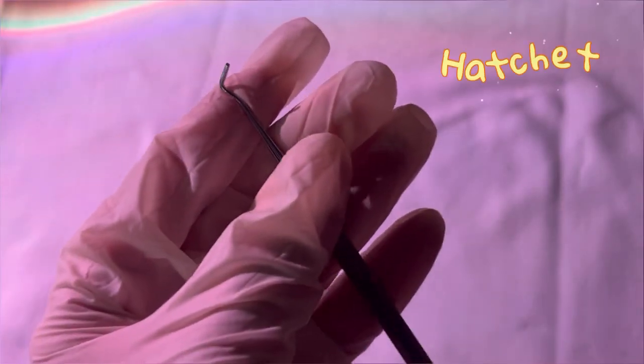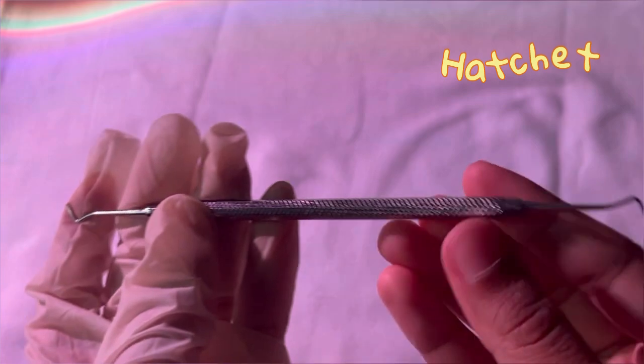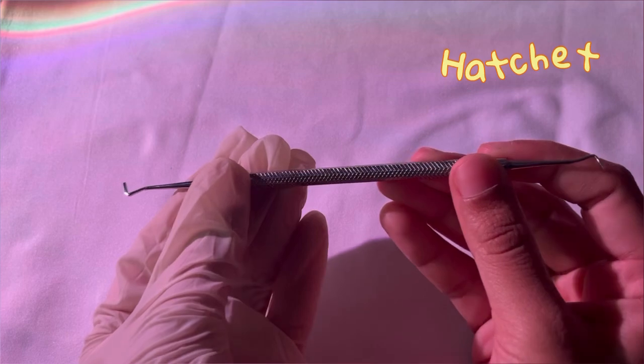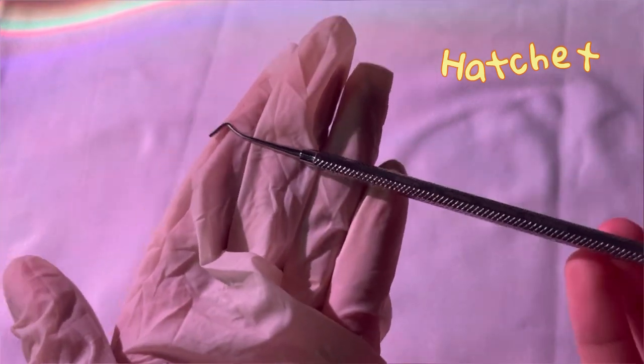This one is a hatchet, usually called the enamel hatchet. This particular instrument is used to break or cut hard tissues like bone and teeth. This is known as a hatchet.